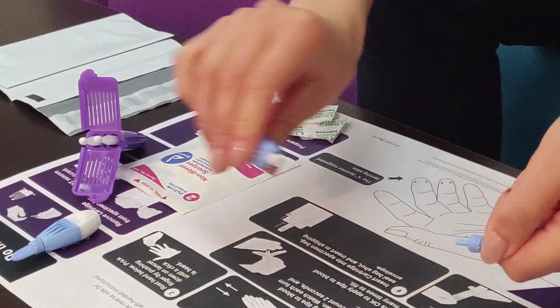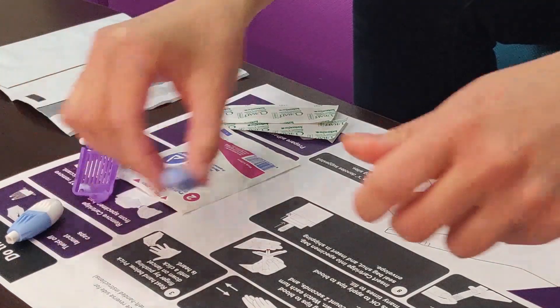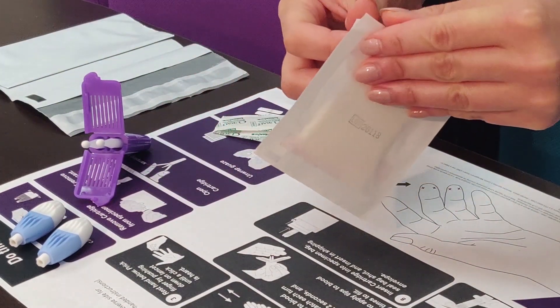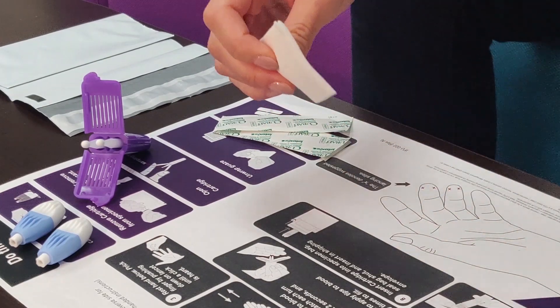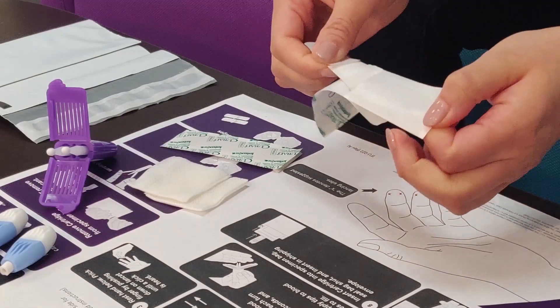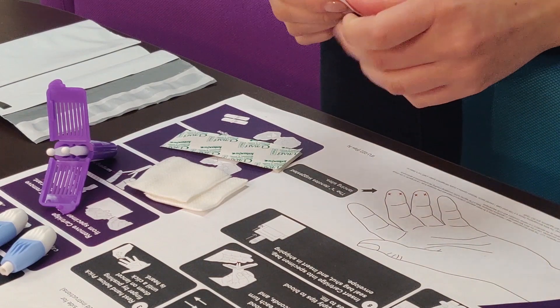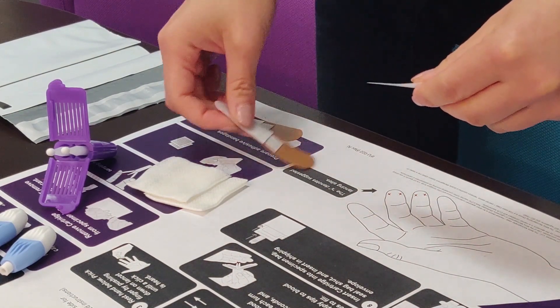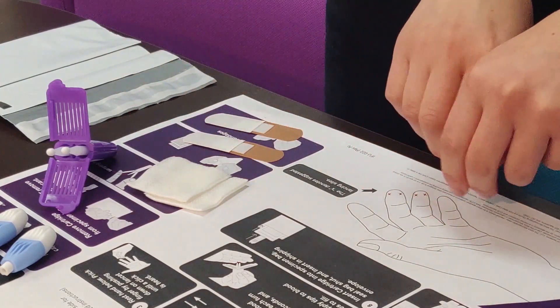Then twist the caps off the lancets. Now remove the gauze from its packaging. Lastly, unpeel the backing from one side of each bandage. Keep all items within reach. You're now ready to collect a blood sample.